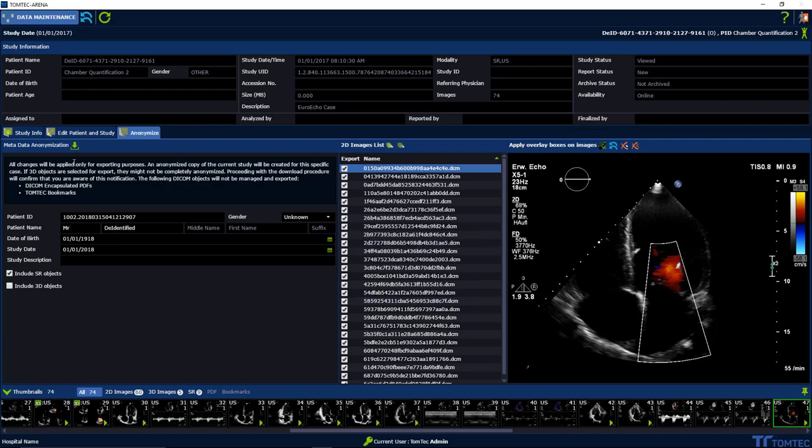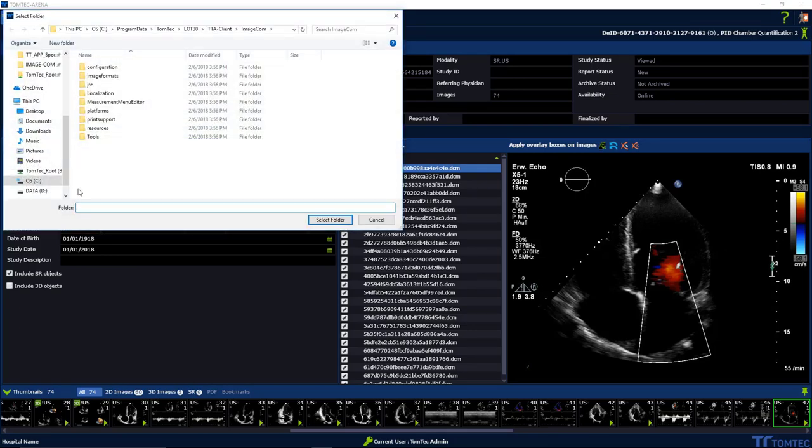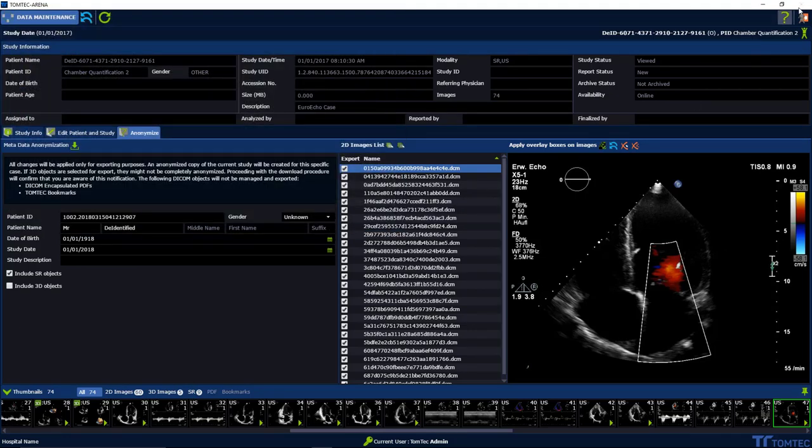Now download the anonymized study. Exit the menu on the right upper hand corner by pressing the X.